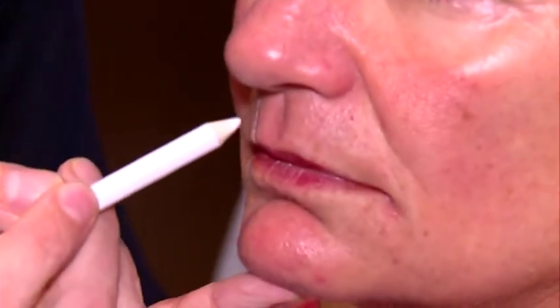So what happens by the aging process? By the aging process, as you mentioned already, the lip inverts. It's an elongation of the upper lip. So what I want to do is an eversion. I want to push the lip outwards. So what I'm doing is, I take the dry wet border and do threads 1, 2, perpendicular line. So can you open your mouth? I see the dry wet border, which is here, and do linear threads 1, 2.